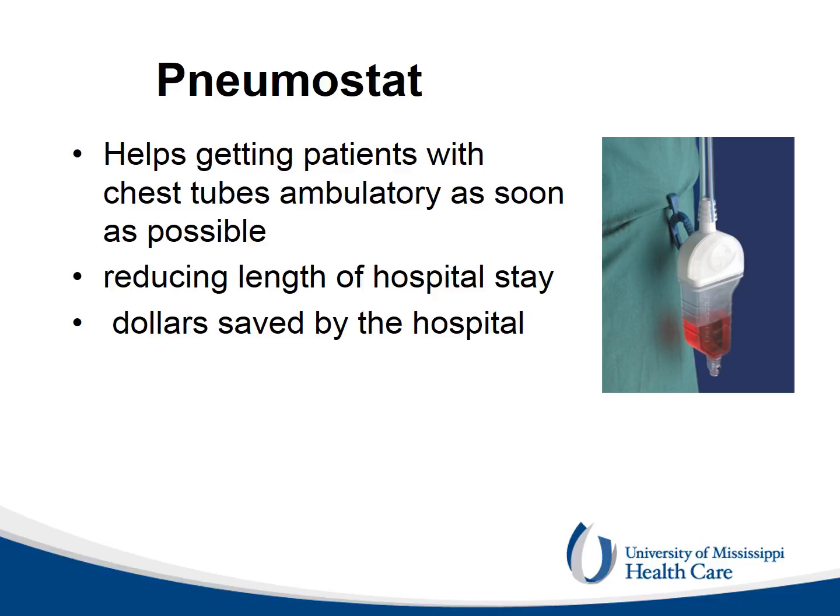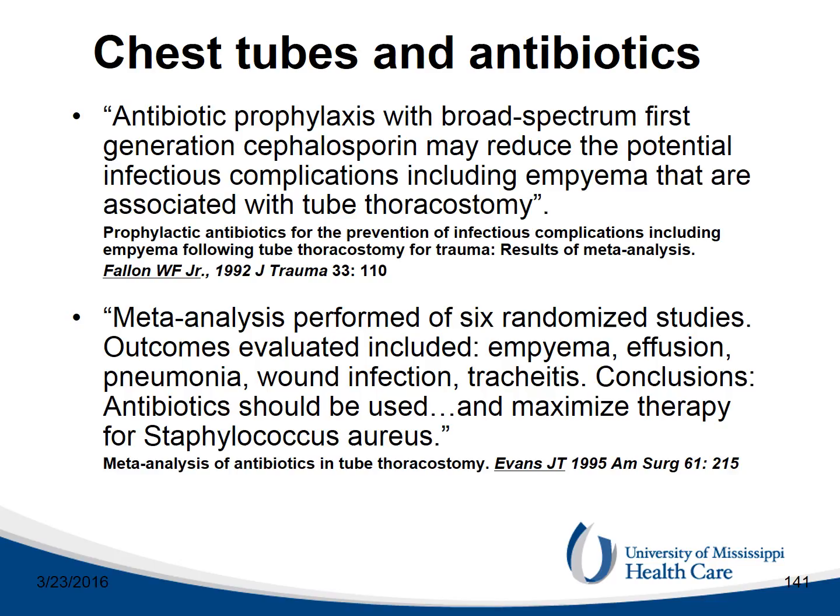A pneumostat is a small collecting chamber with a unidirectional valve that has a function similar to the Heimlich valve and can be easily drained when full. First-generation cephalosporin may reduce the incidence of an empyema after chest tube insertion, especially in the trauma setting.